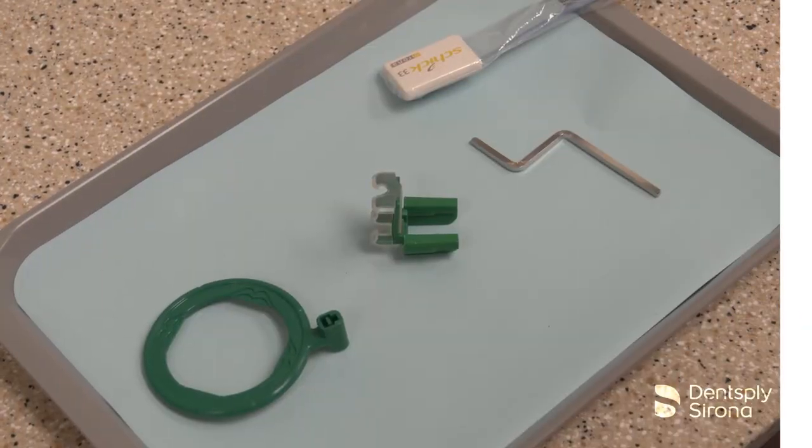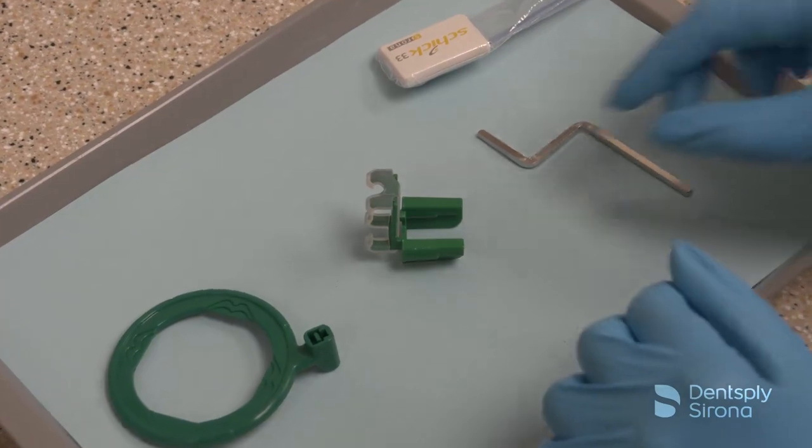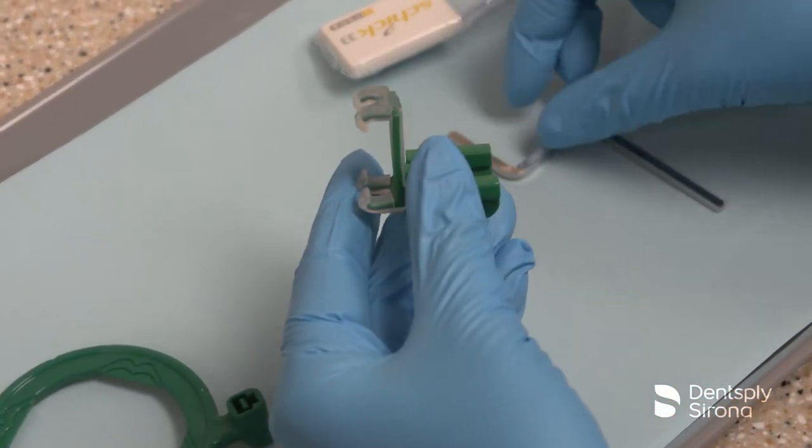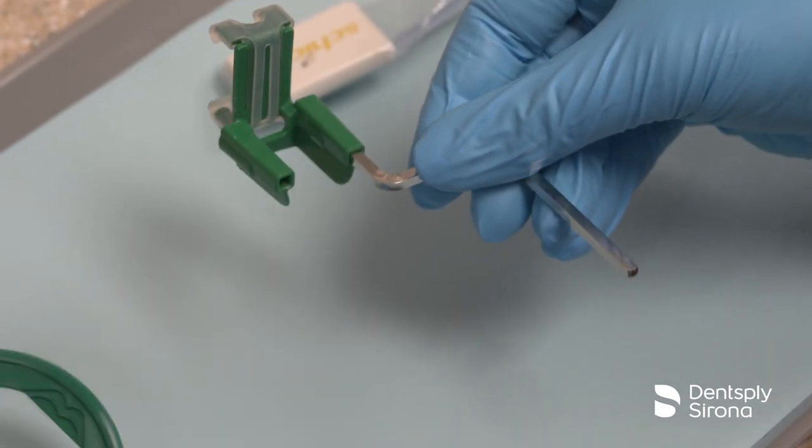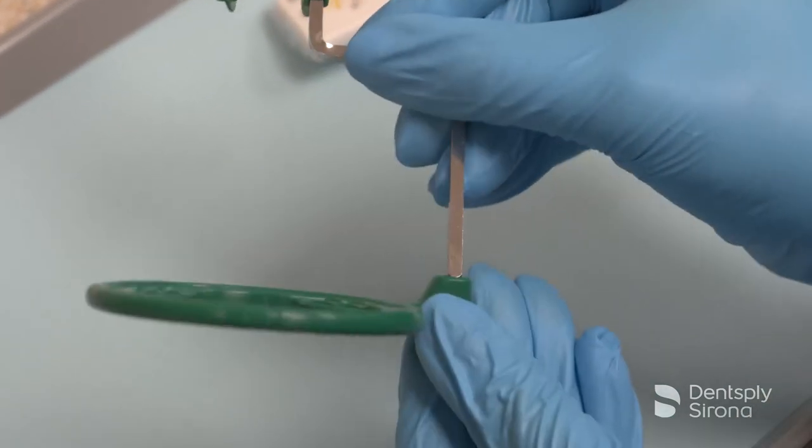To assemble the XCP short arm with the XCP-DS-FIT endo bite block for endodontic images, place the metal arm into the front tab of the green bite block. Slide the arm into the green aiming ring.